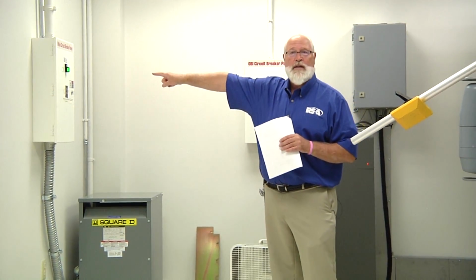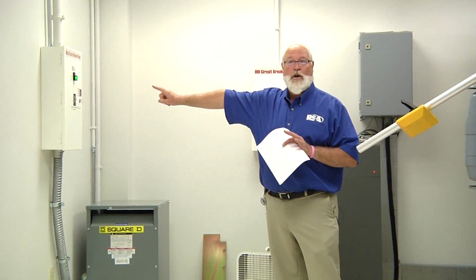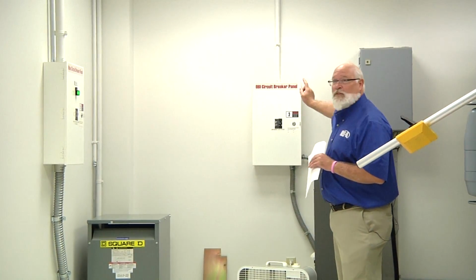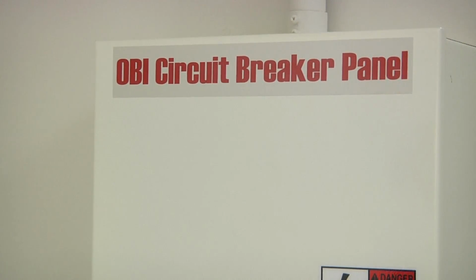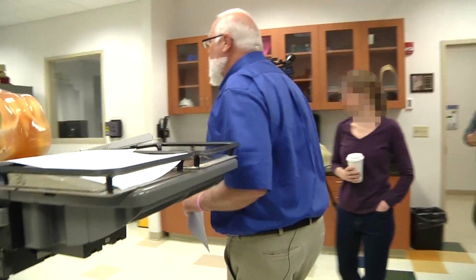This one's 208 in the United States. It may be 240. This one is 480, and that's for your X-ray tubes. So that's where we start to turn on the machine. Then we'll come over to your modulator.